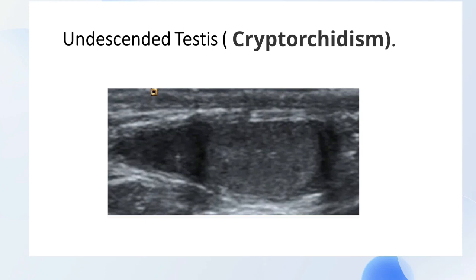If you don't see it, because the testicles can be overlaid by bowel, you have to recommend an MRI so that they check for the testicles, because if they remain inside for quite some time, they can turn cancerous. So undescended testicle is one of the common conditions that you can find, especially in kids or in those people whom it was ignored when they were growing. The problem of undescended testicles can also cause infertility.